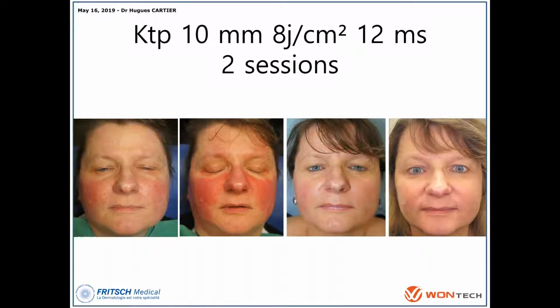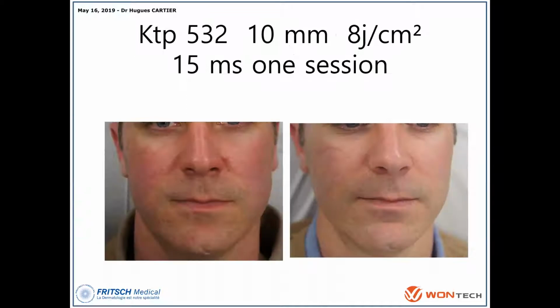rejuvenation also. You know, the complexion of the patient is completely different between the first and the second picture, and it's a reason you can also use this device for photo rejuvenation, only with a KTP, with a green light.